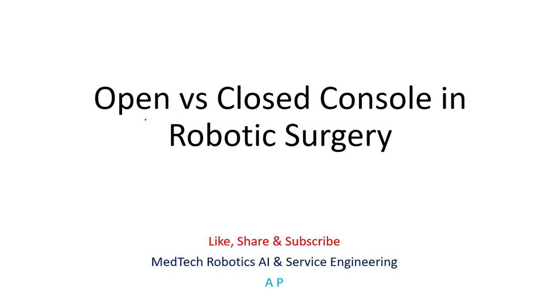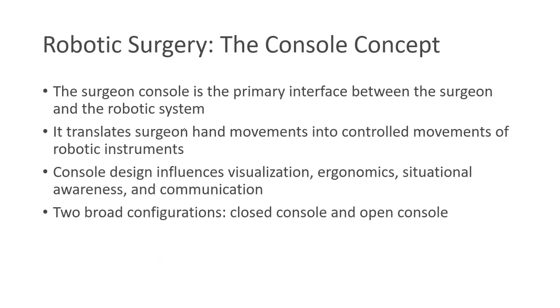So today I am going to discuss the open and closed console of the robotic surgical systems available in the market. So what is an open console and what is a closed console? If you know about robotic surgery, what is the concept of the console? The surgeon console is the primary interface between the surgeon and the robotic system.